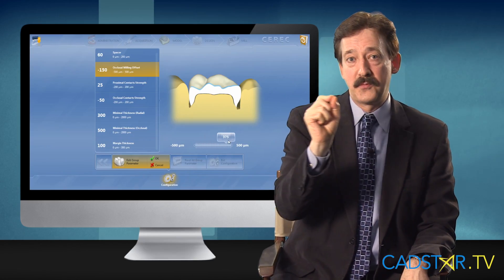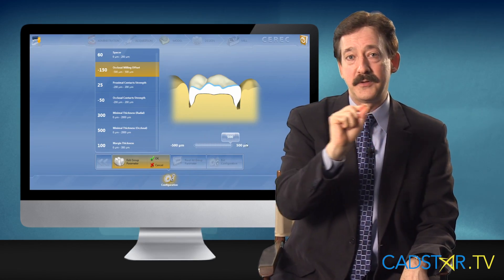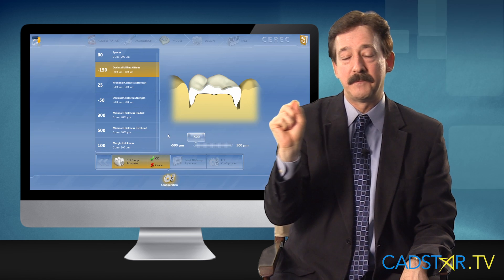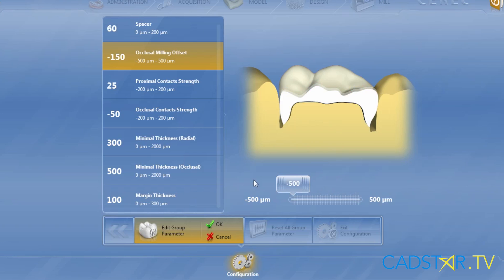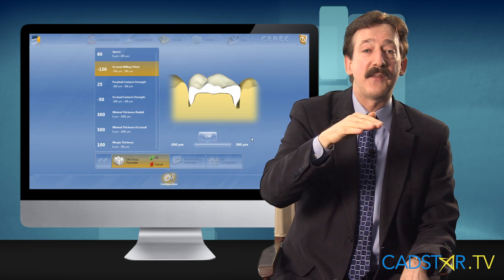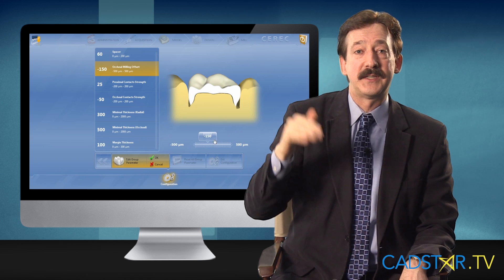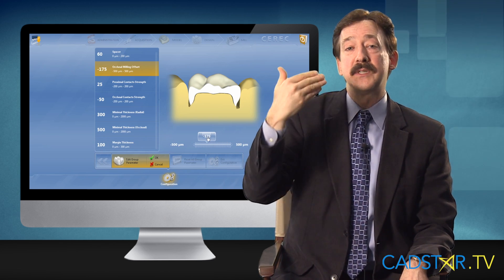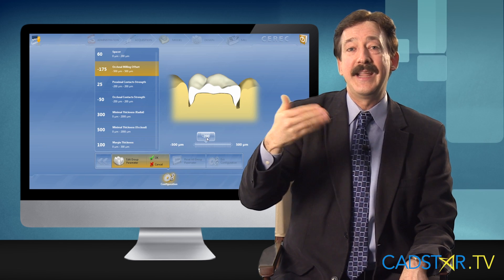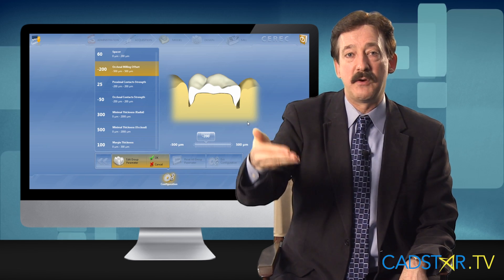When I scroll through the scale on occlusal offset, you'll see the whole occlusal surface either go up or go down. You will not see that effect on your design screen — it only shows up as a result in the milling outcome.